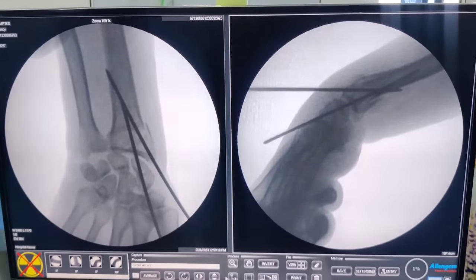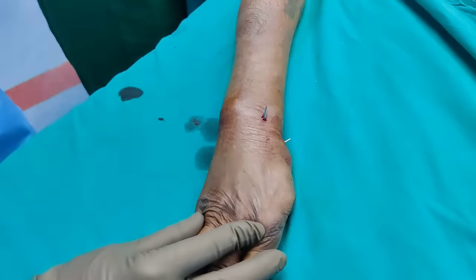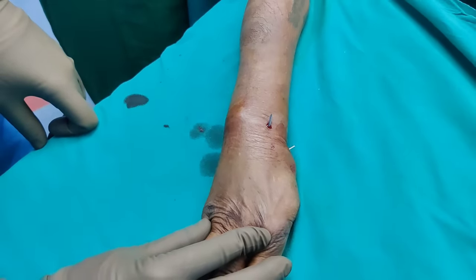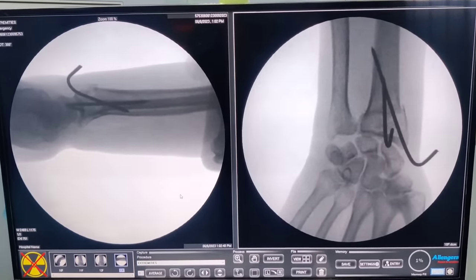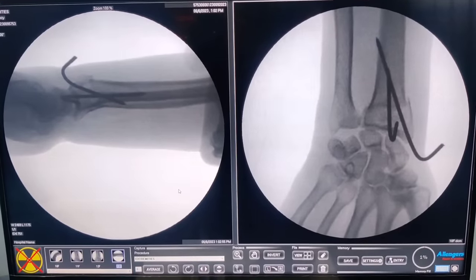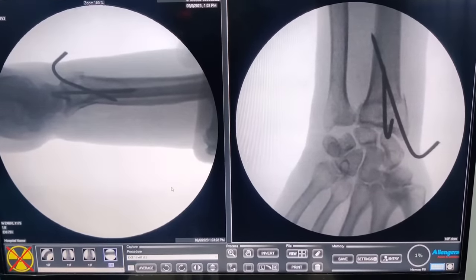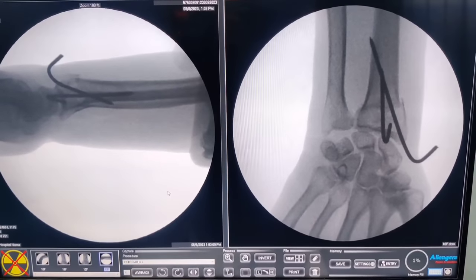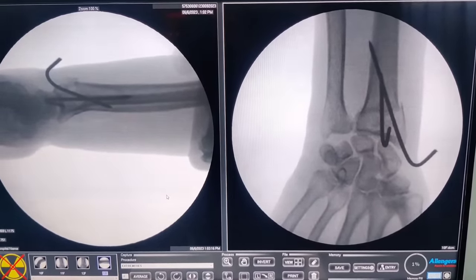We have cut the wires and taken the final images, and this is how you do a K-wire of the distal radius. The final position is pretty good and I am happy with what we have done. We are going to put her in a back slab for roughly 2 weeks, then immobilize the hand for around 4 to 6 weeks in total, after which we will get her going. For all patients with distal radius fracture I prescribe vitamin C for around 3 months — it decreases the incidence of CRPS.